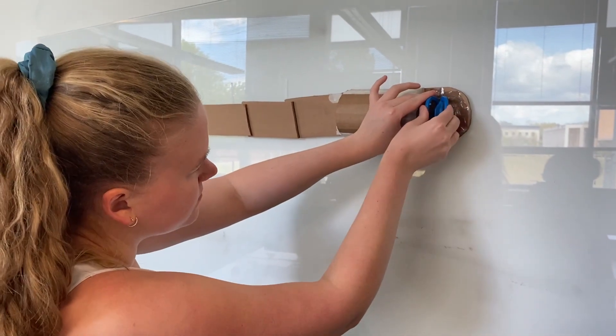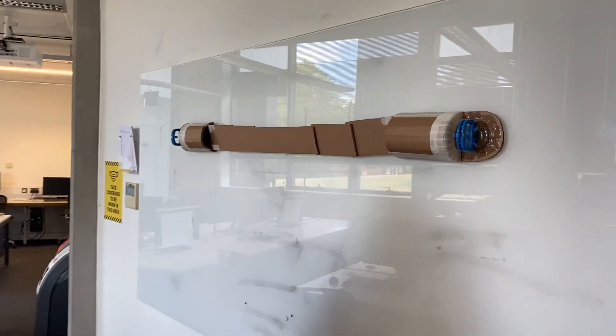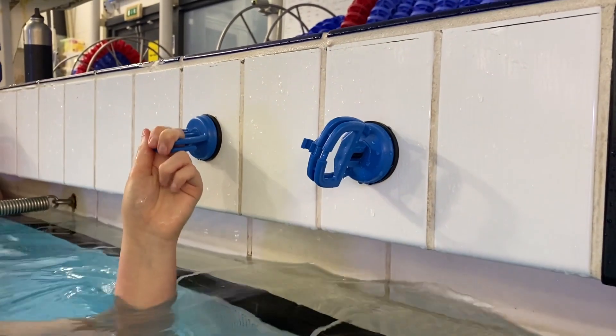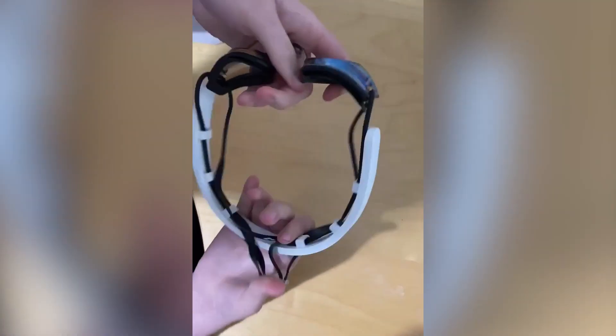OPTIC consists of two poolside devices located on either end of the pool on the pool wall. These will be placed by the coach before a training session or before a competition. There is also a wearable that the swimmer wears on their goggle line, which the swimmer will place on their head before training or competition as well.